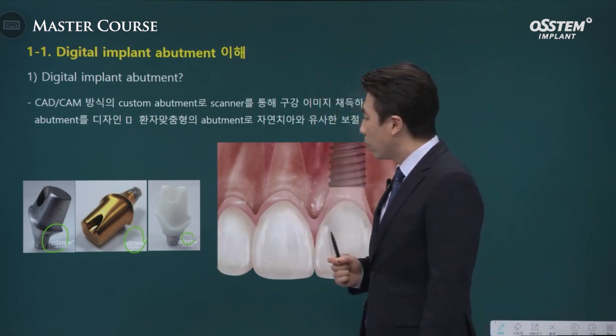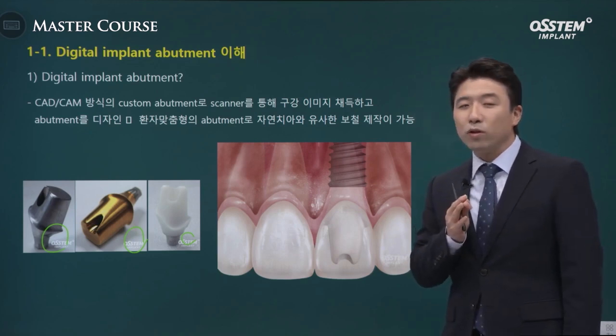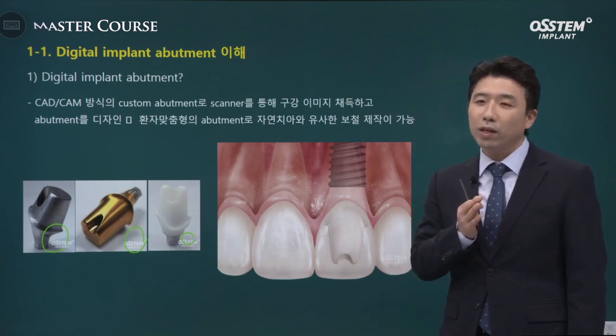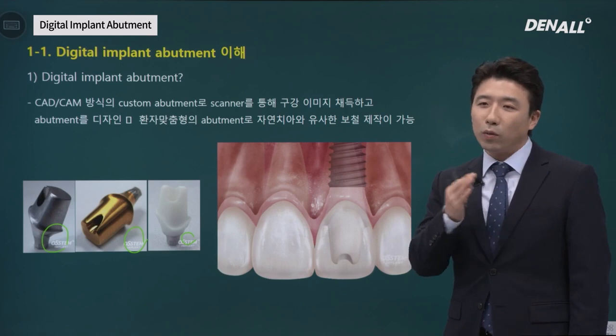This needs to be customized to the patients. We need to determine whether aesthetics or function or intricateness is most important. Depending on the situation, we can use different abutments.